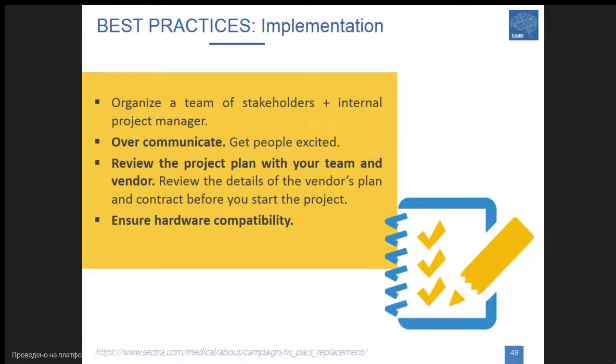For the next step, for implementation, what is the best practice? First one, the key is organizing a team of stakeholders and an internal project manager, so the one who's running the project. The recommendation is to over-communicate, so talk, meet a lot in order to look forward and plan for all possible faults, and to be sure that everybody understands the scope of the project.